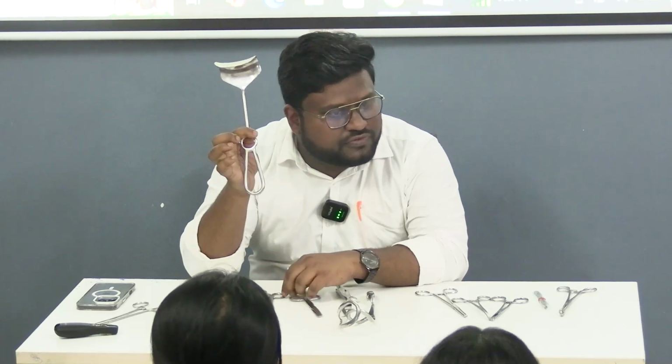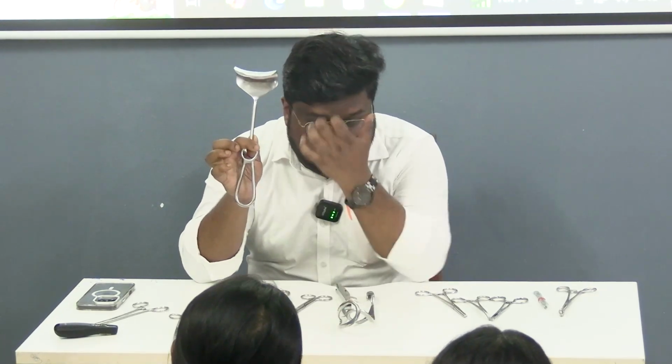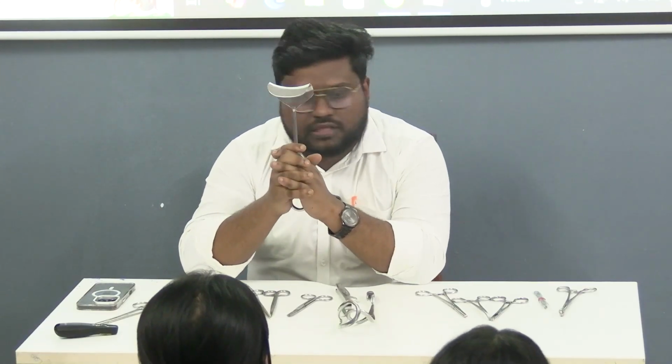ও তার আগে this, you saw this being used. This is a Doyen's retractor. Use? Urinary bladder. Retract the bladder. Acha. Simple answer. Retract the bladder. Examiner at the simple thambe na. He's going to ask you, when do we put this? When do we remove this?